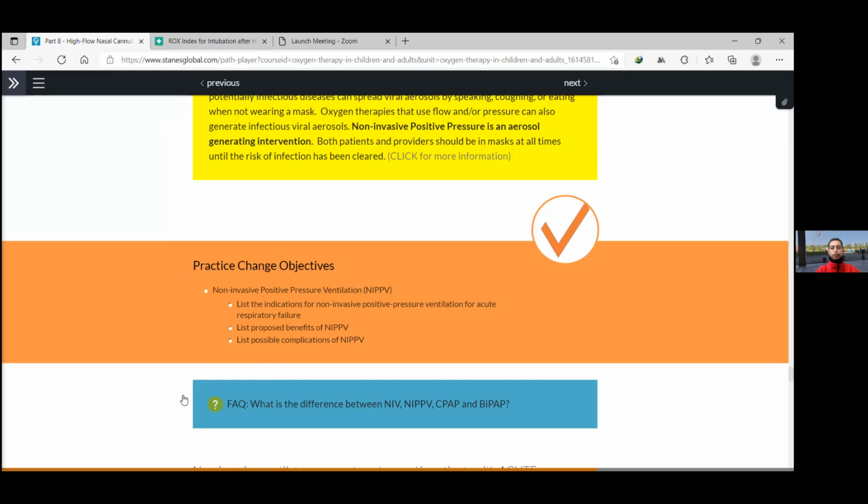So our first question: can you differentiate between non-invasive ventilation, non-invasive positive pressure ventilation, CPAP, and BiPAP? Can you just briefly describe them in the chat box?